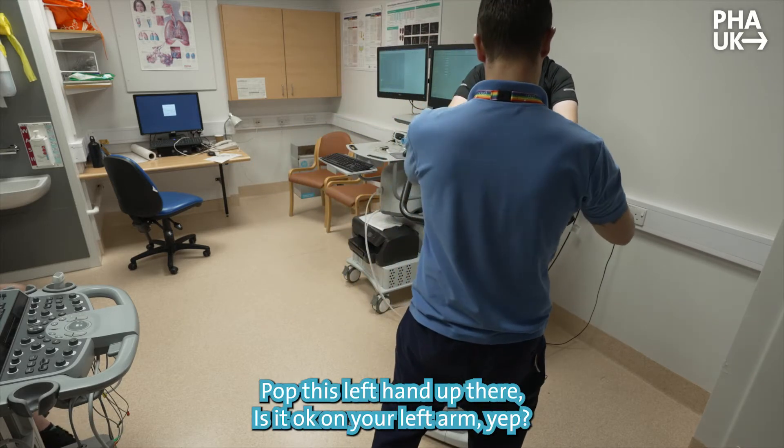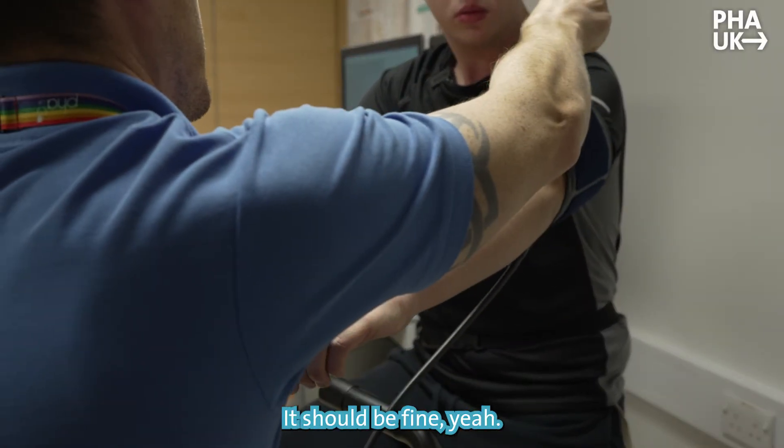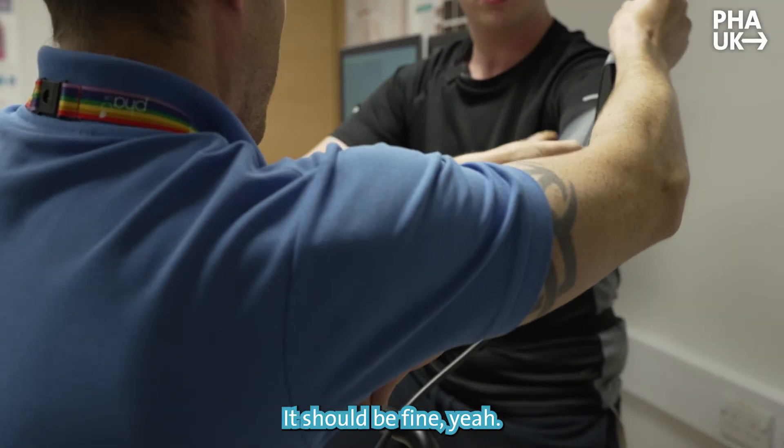We're going to pop a blood pressure cuff on here. Pop this left hand up there. Is it okay on your left arm for blood pressure? Should be fine there.